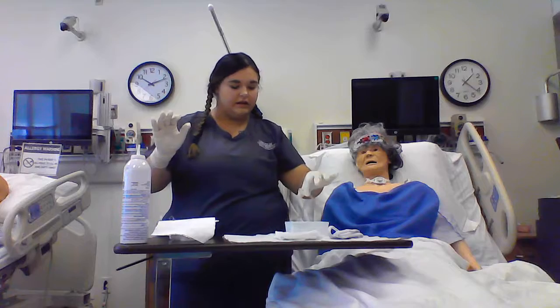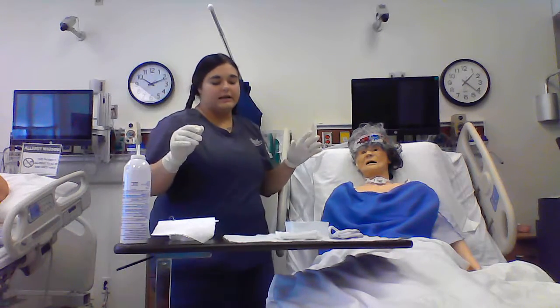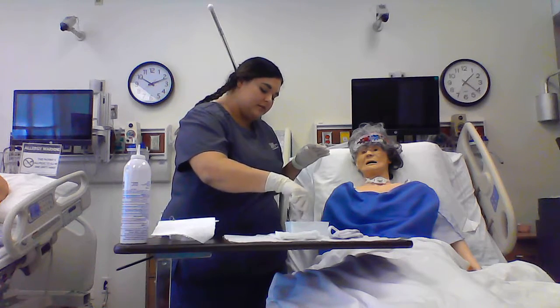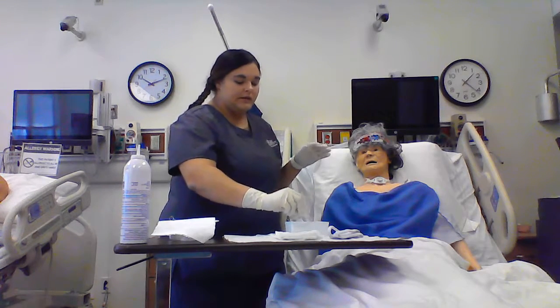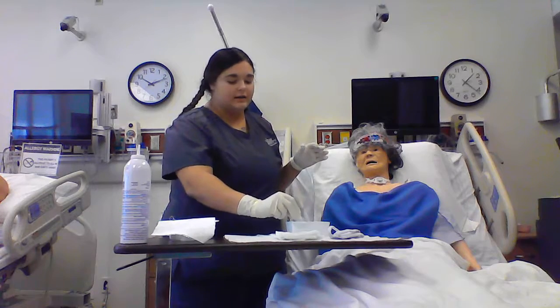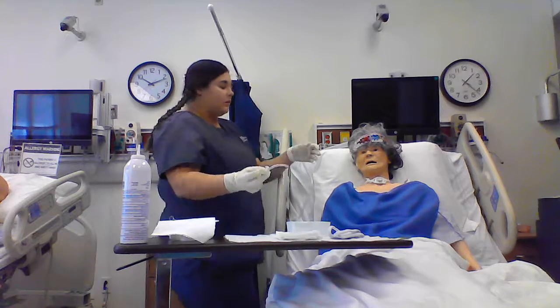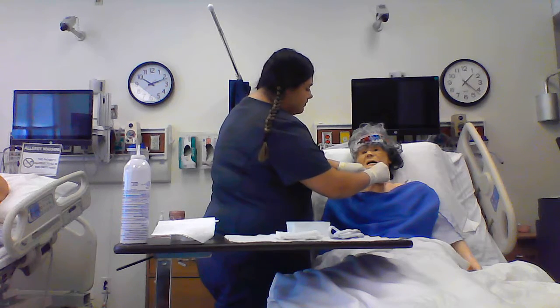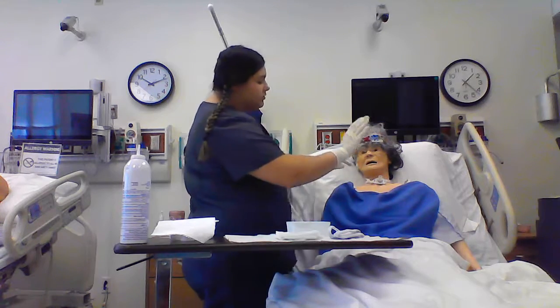I'm going to put my inner cannula in my sterile saline, and let it wash off some of that hydrogen peroxide mixture here. I'm going to grab it with my dominant hand and tap it on the middle of this container. I'm tapping it to make sure that all the water gets out of this cannula because you don't want to introduce a whole lot of water into your patient's respiratory system. I'm going to go ahead and put this back in, staying as sterile as possible.